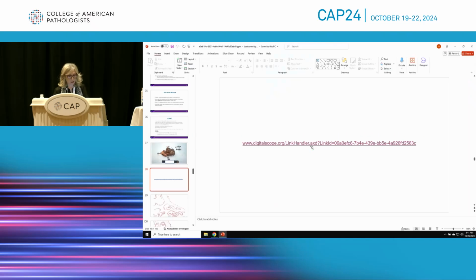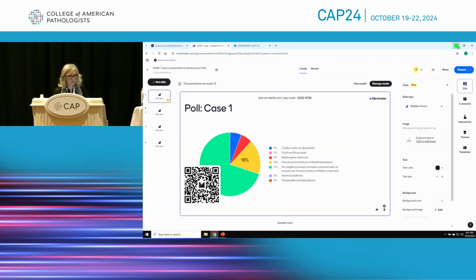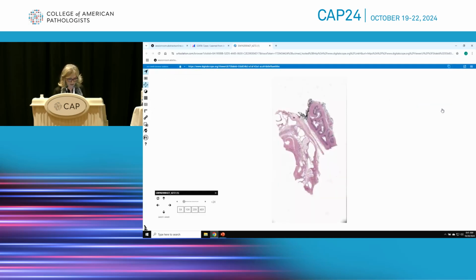Okay, so here I actually have this already pulled, so we don't have to wait for the slide to... Okay, we may have to wait for the slide to refresh. Okay, so this is one of the representative slides.